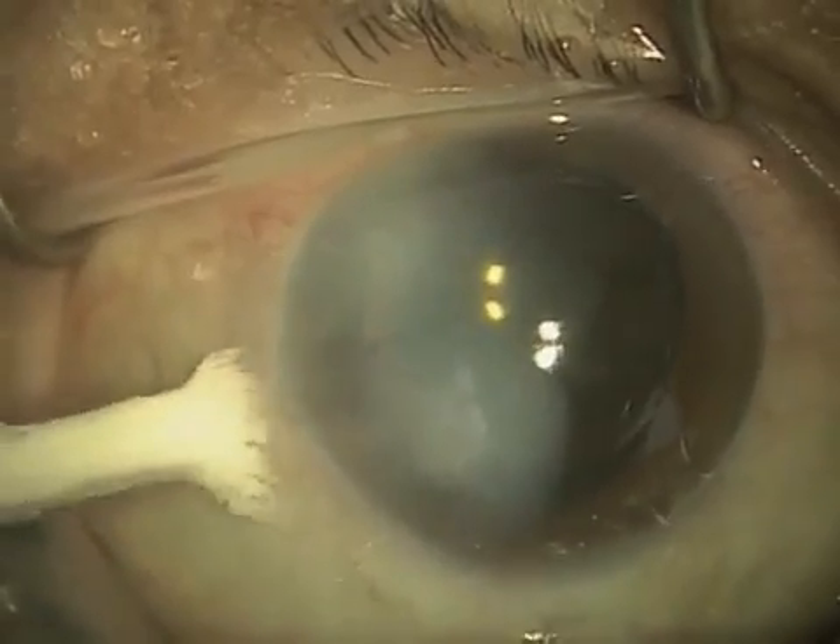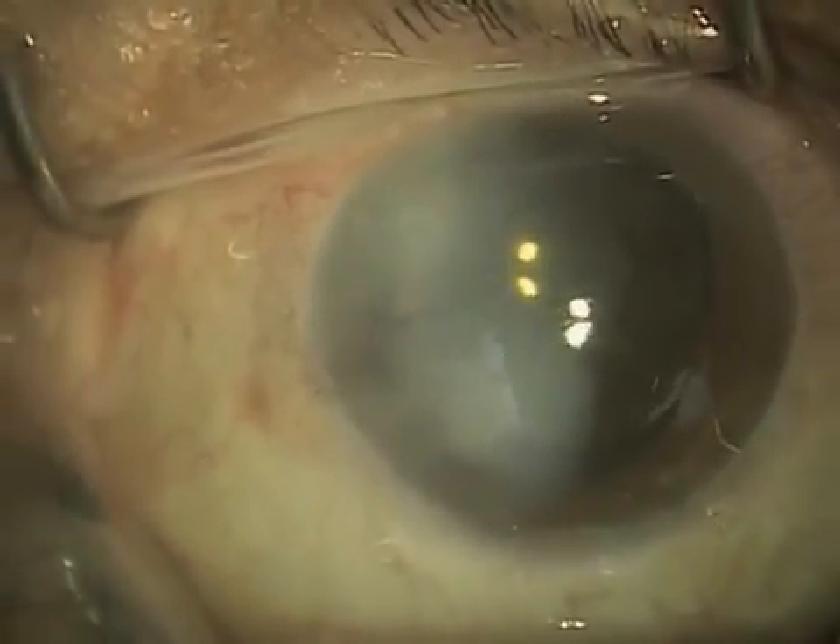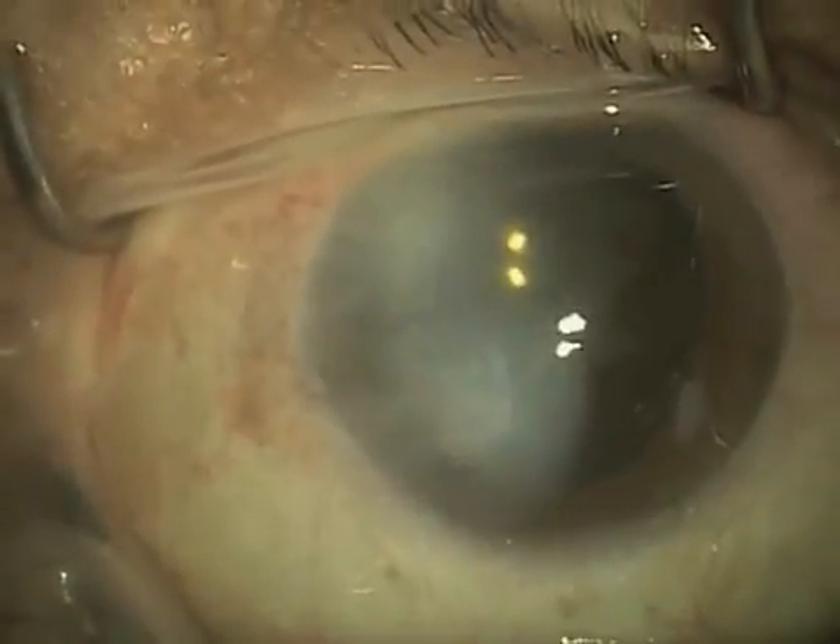Here I'm actually testing the incision with what we call a Weck-cell. And it's tight — water tight. The incision looks good. Checking the pressure here. Pressure looks good. And we are done.